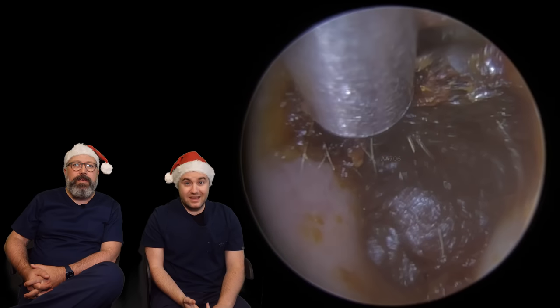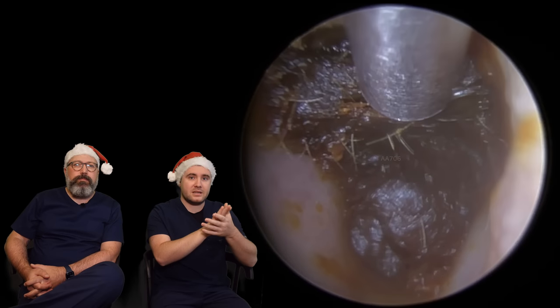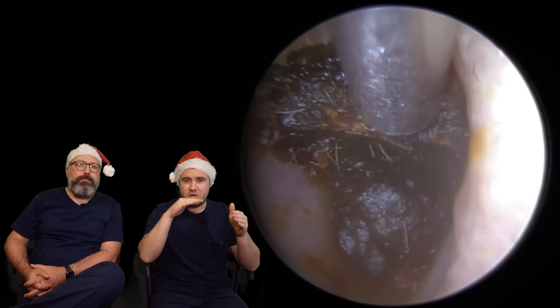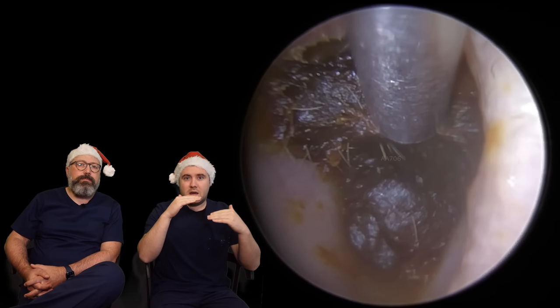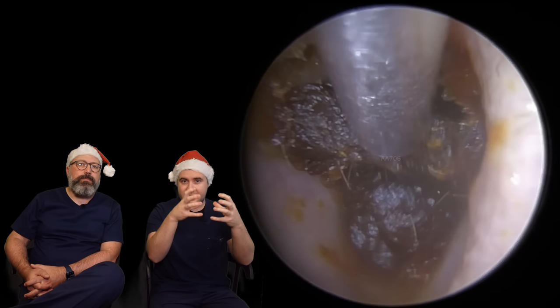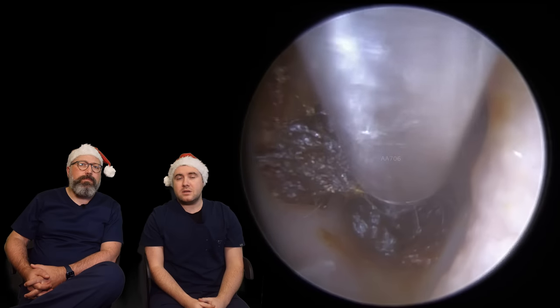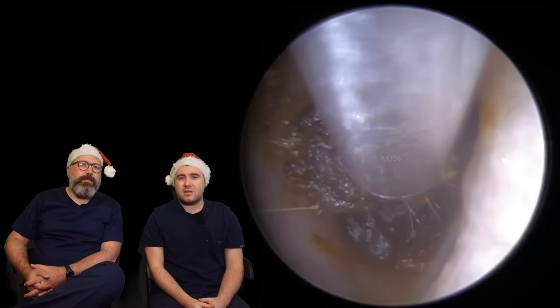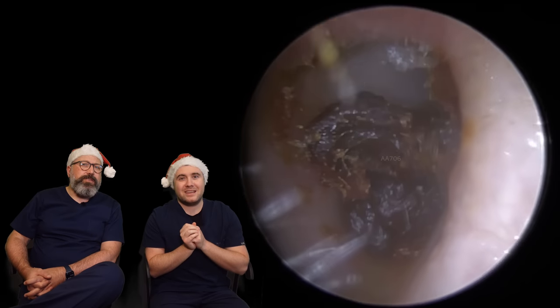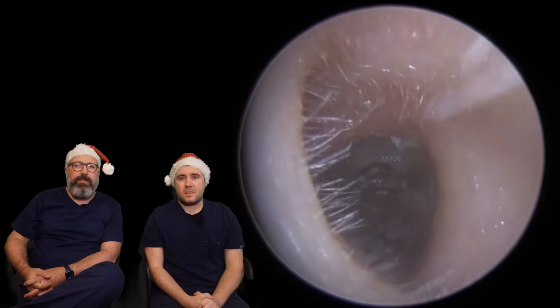We are lucky in this case, as the wax at the top hasn't been compacted anywhere near as much as that bottom section. So you can see here, I'm just trying to almost get a suction grip on that wax. You can see that side bit there starting to come loose, so I'm trying to just roll this forwards. But I don't think this is all going to come out in one go. It's super sticky, this one.